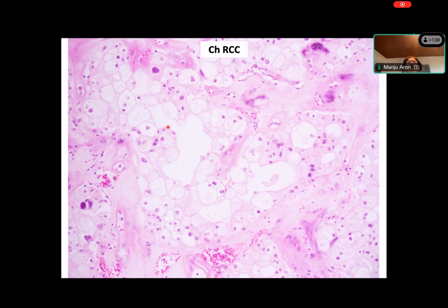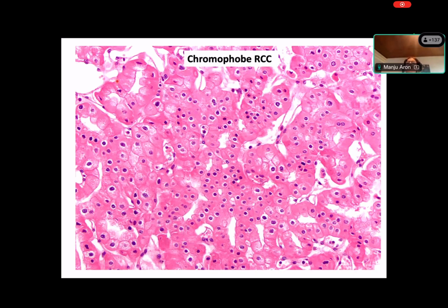And this is an example of a chromophobe RCC, which is mostly pink, and so you don't see that pale staining appearance of the cytoplasm.